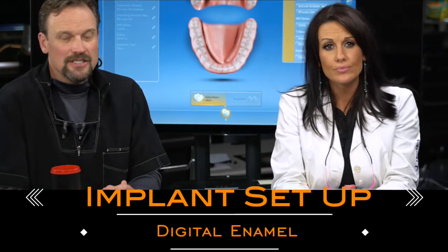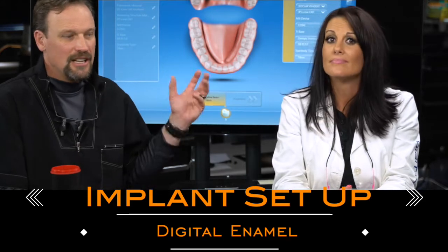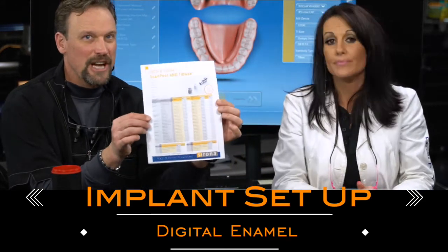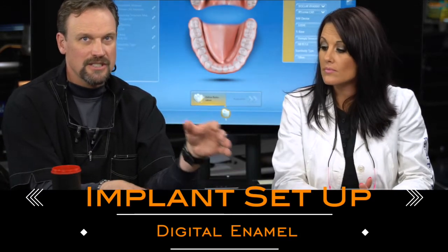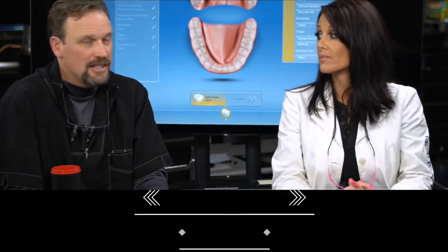The main thing about doing CEREC implant abutments is being organized, setting it up properly, having the right information right in front of you at all times, and then keeping the components together in one little section — it's going to make the restorations go a whole lot easier.